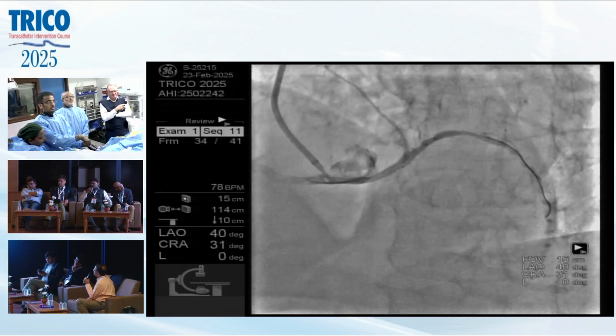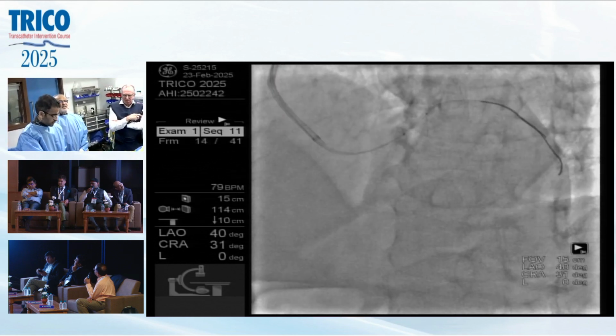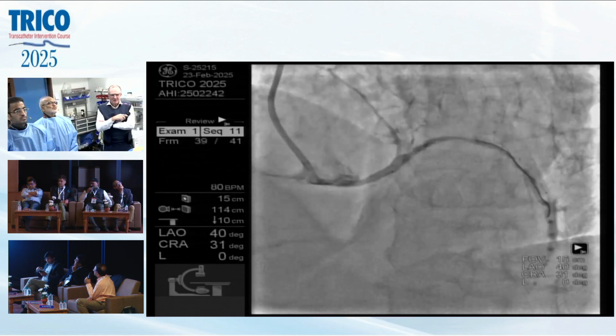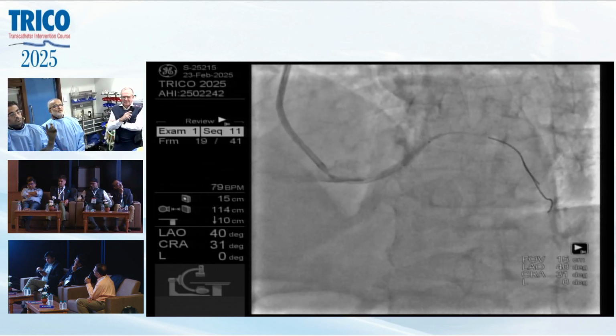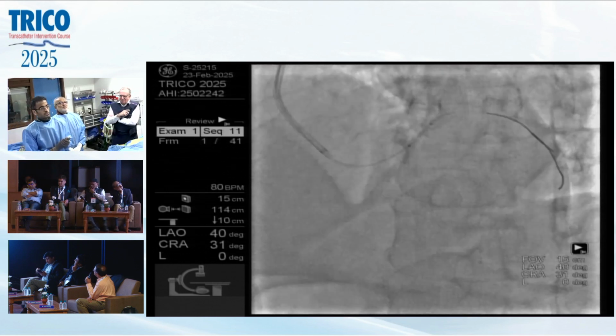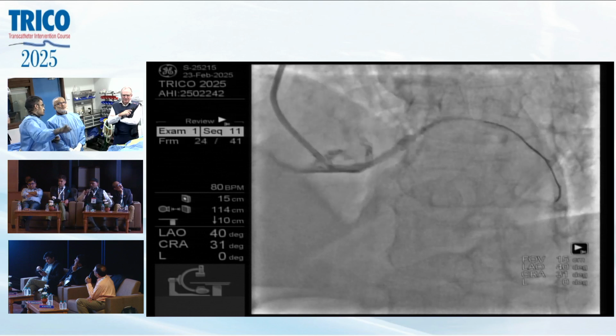Proximal is somewhere around 2.75 to 3. Distal is 2.25. What to do? I think a 2.5 can go up to the proximal size most likely. So what do you think should be the length of the stent? This balloon is a 15 millimeter long balloon, so that will give you at least 30 some.